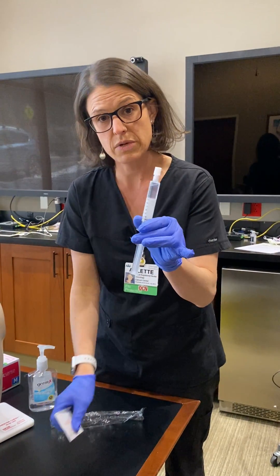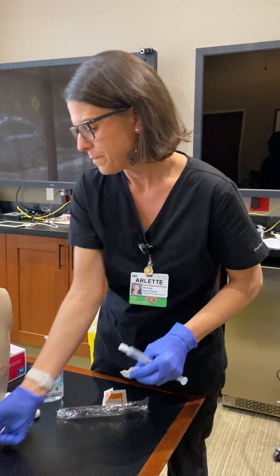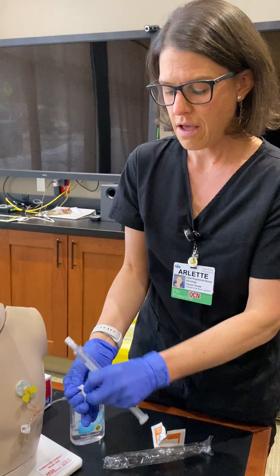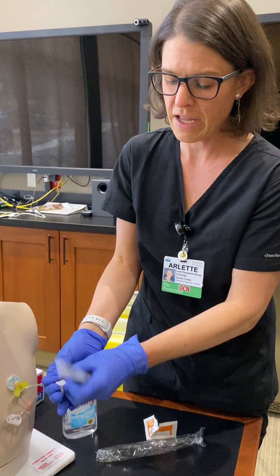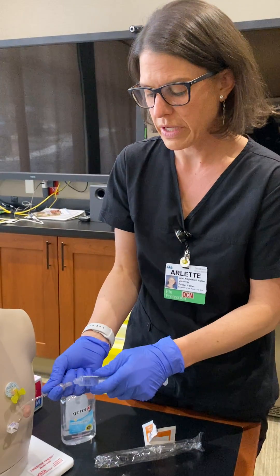In this situation these syringes are fine; you don't need to use a sterile syringe. You will clean the hub of your line. If you have one of the orange caps on there that's adequate. If not, you want to do your twist 10 to make sure it's nice and clean before you hook up to it.